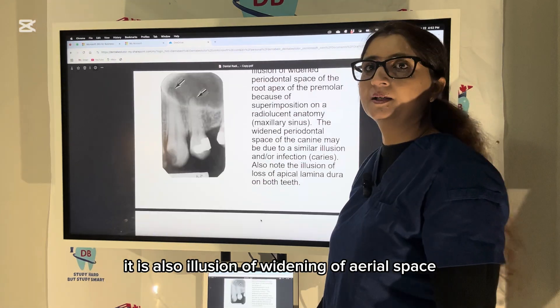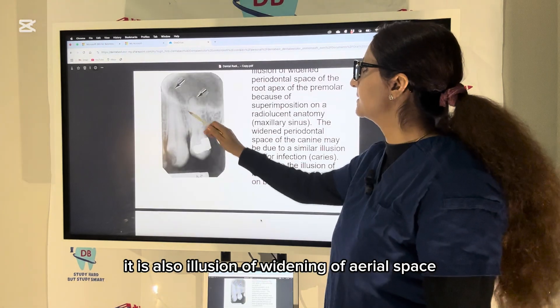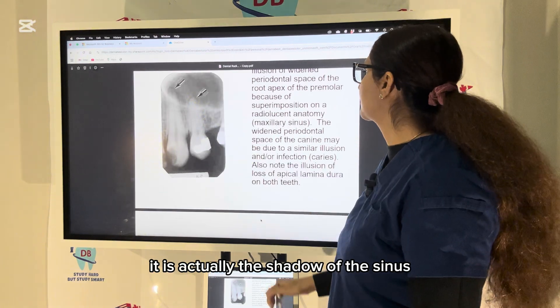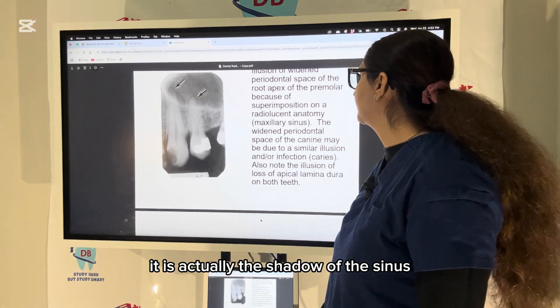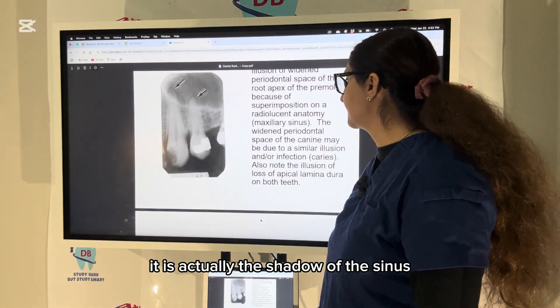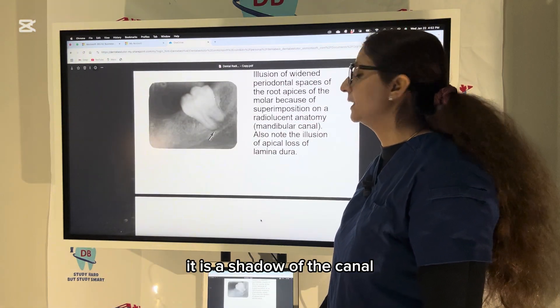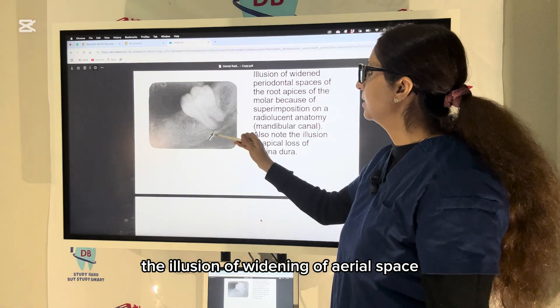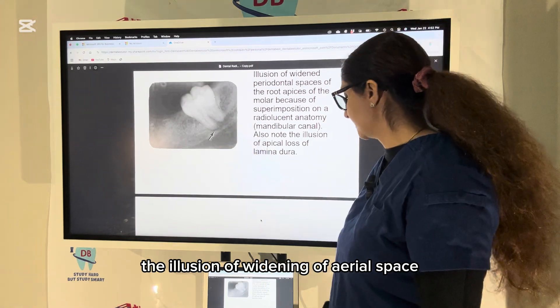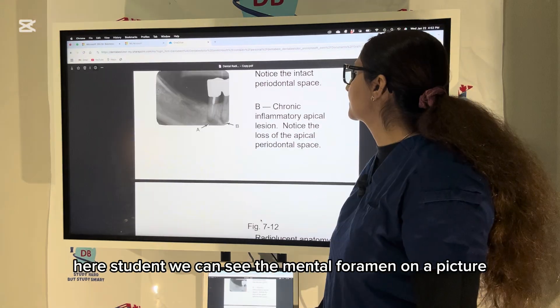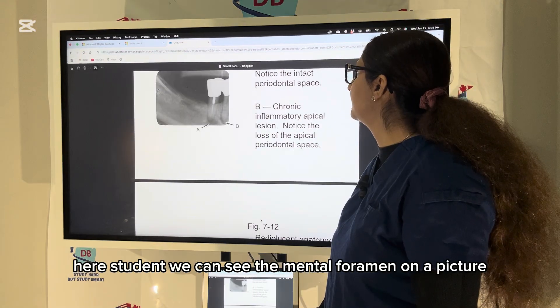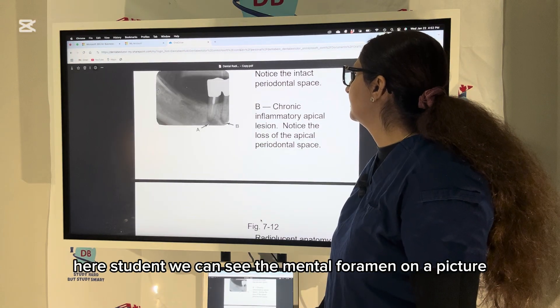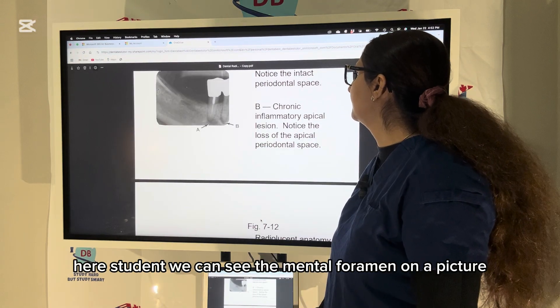This is an illusion of widening of the periodontal space — this is actually the shadow of the sinus. Here is a shadow of the canal that is giving the illusion of widening of the periodontal space. Here we can see the mental foramen.